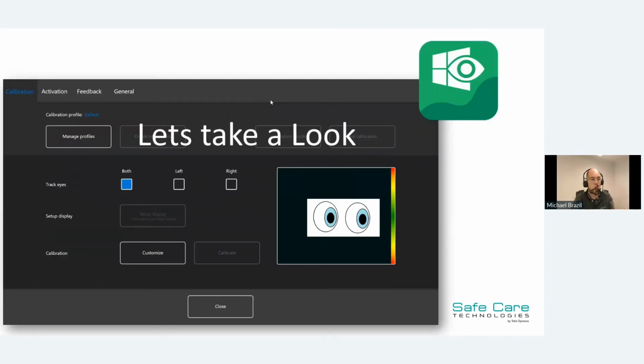So what I'm going to do now is get a device. I have an iSeries here with me and I'm going to open up the eye tracking settings. Just bear with me now. I'm going to switch the screen share over onto the other device, and rotate that around.